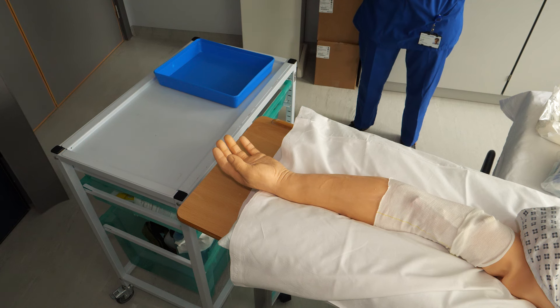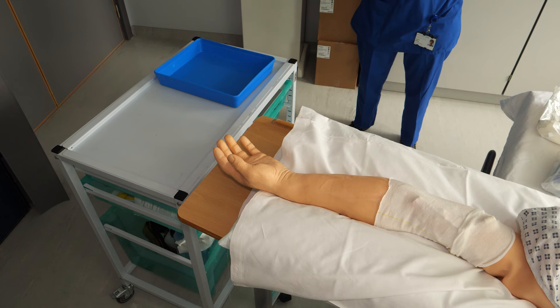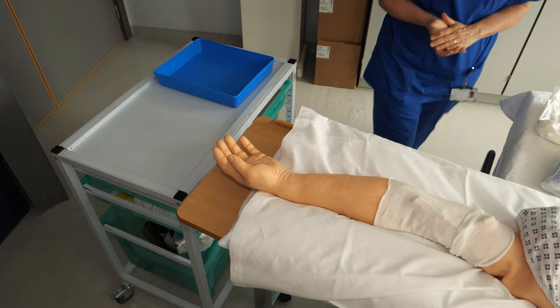Welcome. We do appreciate that caring for a PICC line can be a daunting task. Remember, you are not alone. You have this video to follow, and if needed, you can contact the Oncology Day Unit.